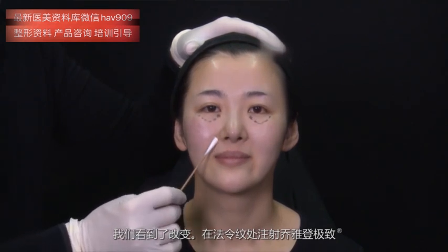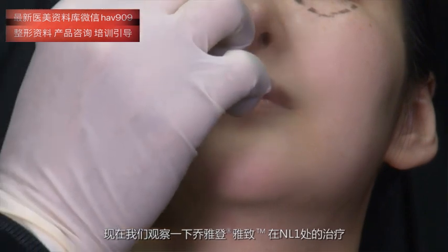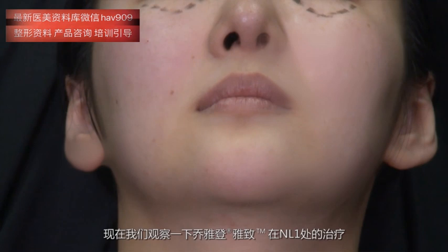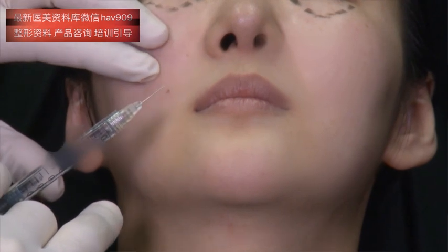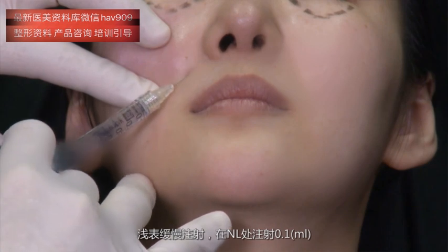Now it's time to inject Juvederm Ultra in the nasolabial folds. Now let's observe the treatment of Juvederm Ultra in NL1. It's a superficial injection.